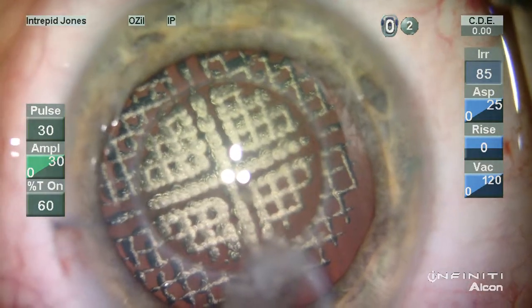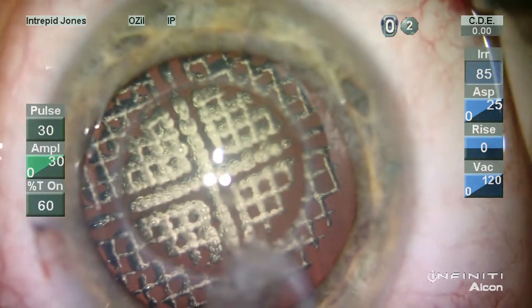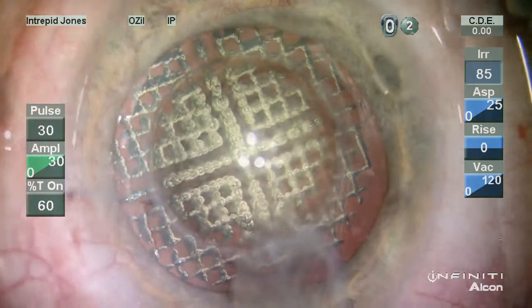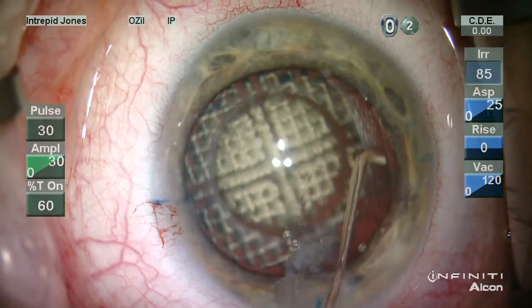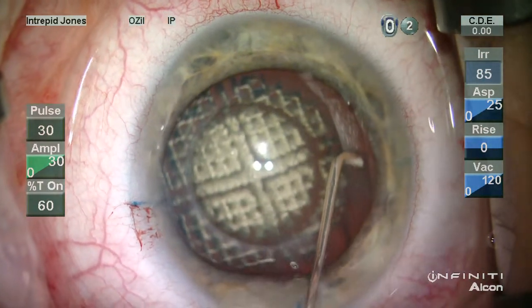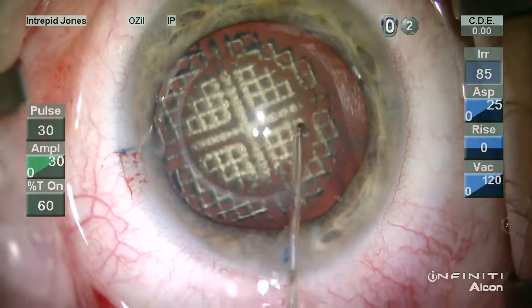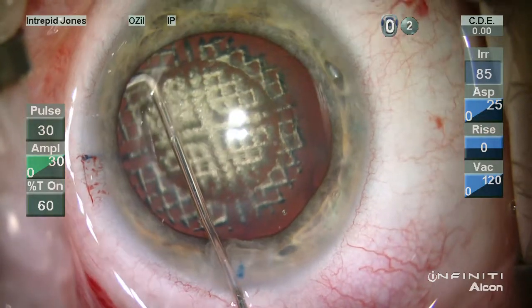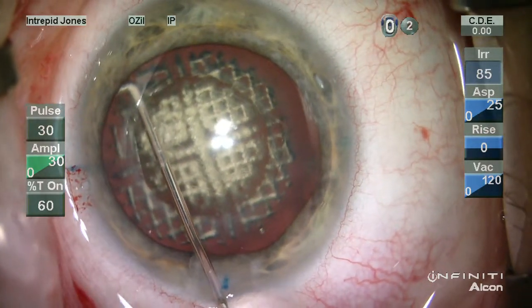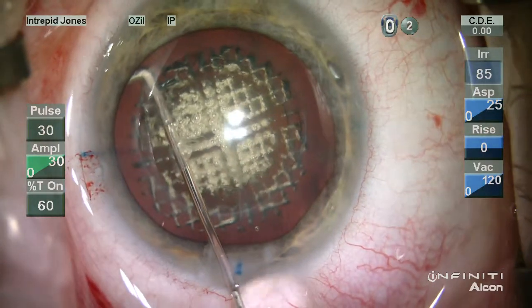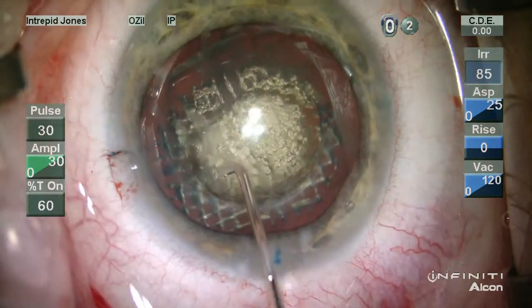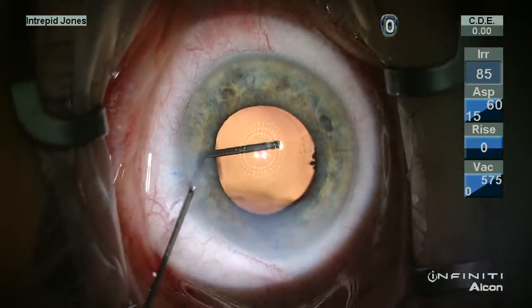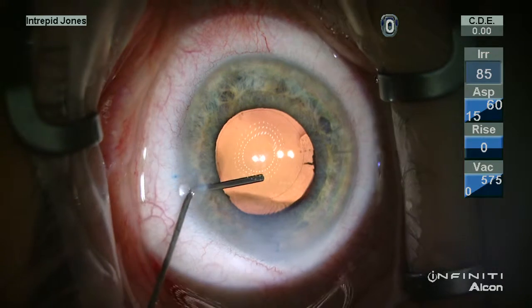Intraoperatively, we are treated to a beautiful view of a 3D array of these bubbles. And as you can note here, the lens is rather soft and is readily removed from the capsular sac.